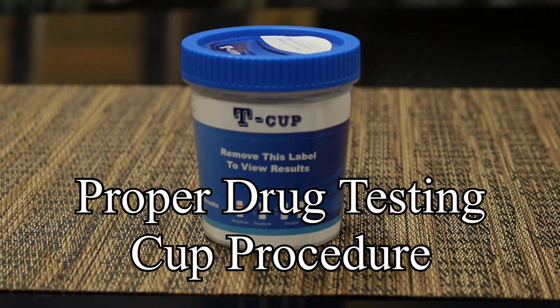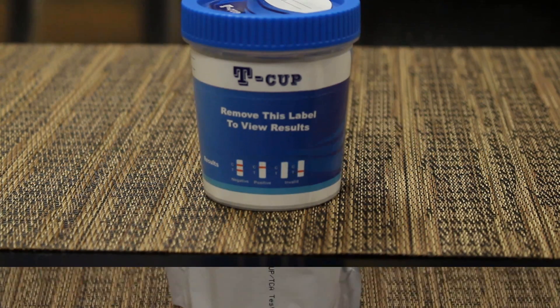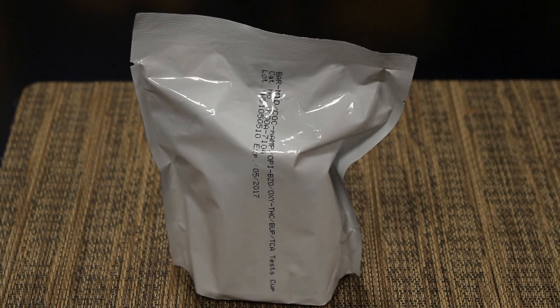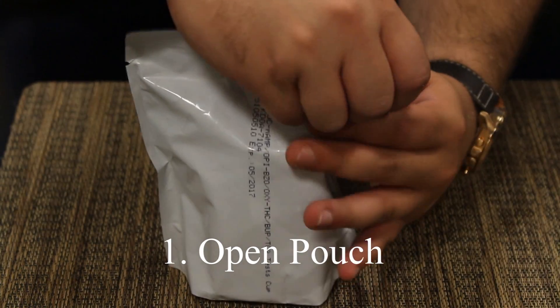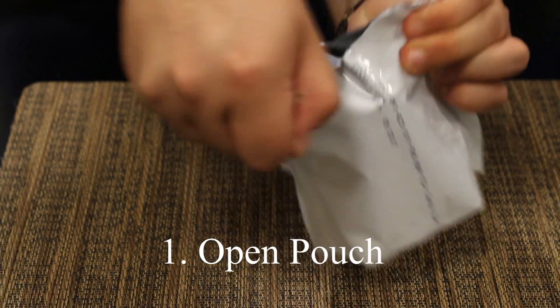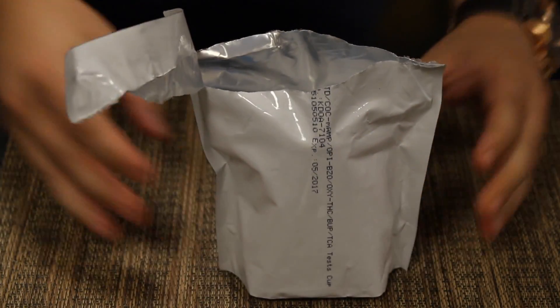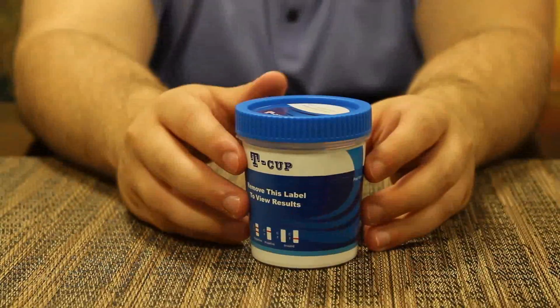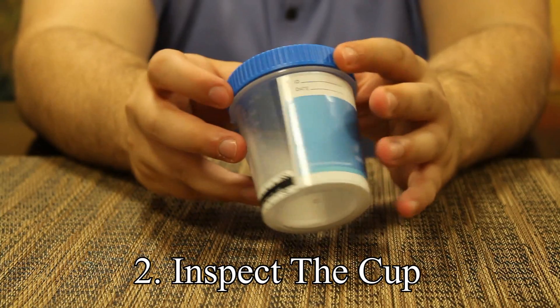This video is for proper drug testing cup procedure. Step one: open pouch. Step two: inspect the cup.